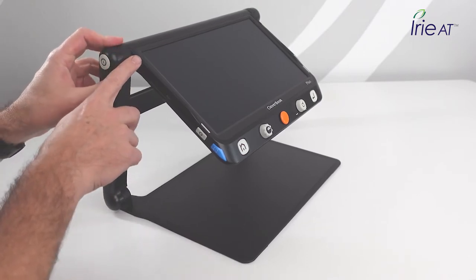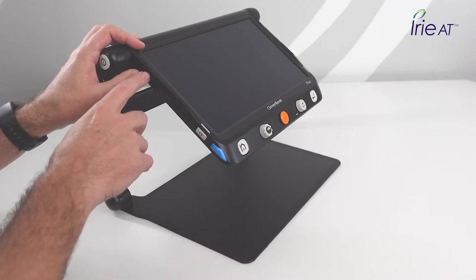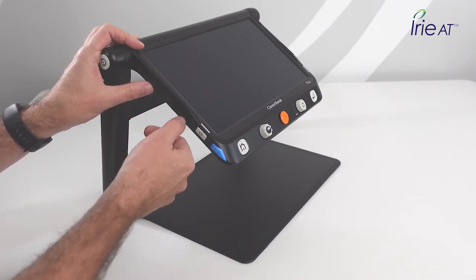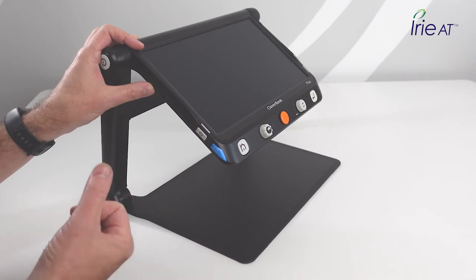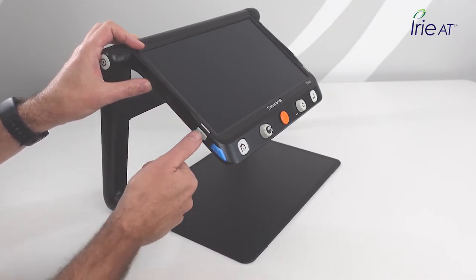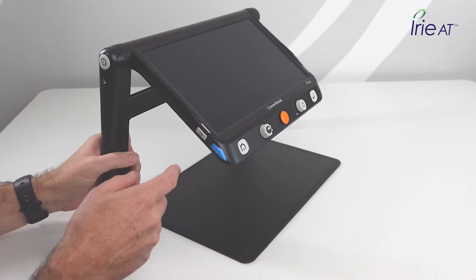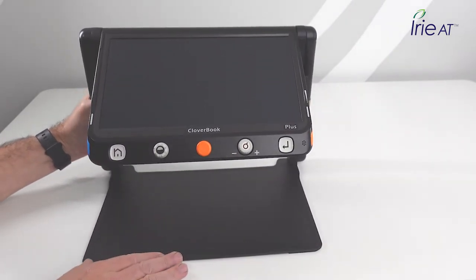Starting from the left arm and working down: on the left side of the screen you'll find a USB service port — that's for technicians, you don't need to use it. Just below that is a slot for an SD card. You can put images onto the device or retrieve them — recipes, whatever you want — and expand your storage. Below that is a rectangular white button, the camera switch button, which switches between the close camera under the screen and the distance camera. On the left corner is a blue button — that's your lines and blinds button.